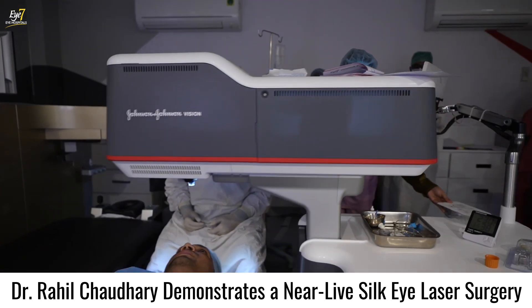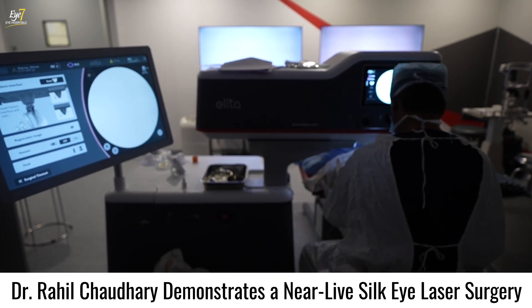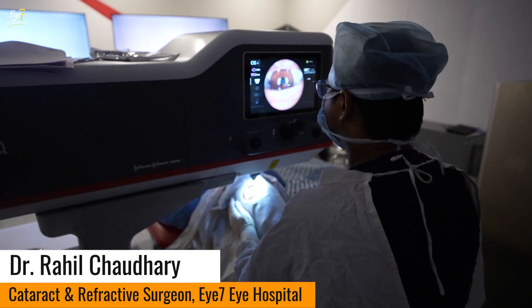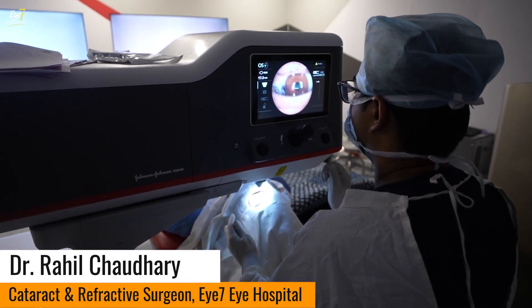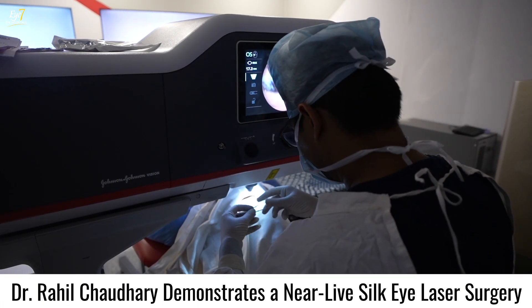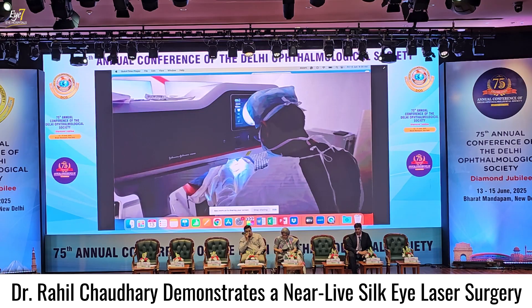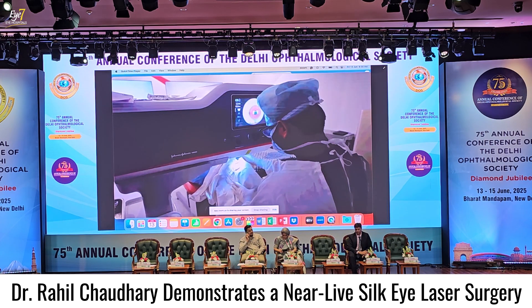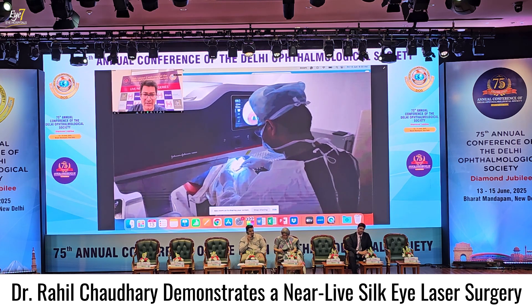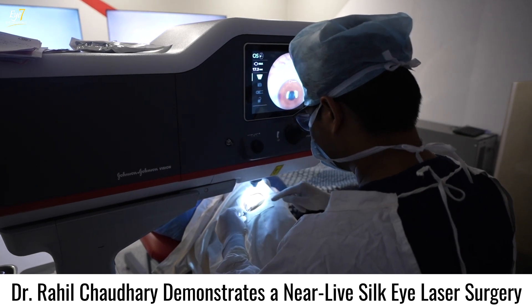Now the patient is on the bed. I have kept the machines independent, though you also have the option of attaching the machine to a common bed with the excimer laser. I prefer to keep it independent so that all machines can be used at any time. Now putting the speculum onto the patient's eye. The beauty of the Irita machine is that you can use it without a speculum, but for beginners I recommend using the speculum, and I feel very comfortable with it on.